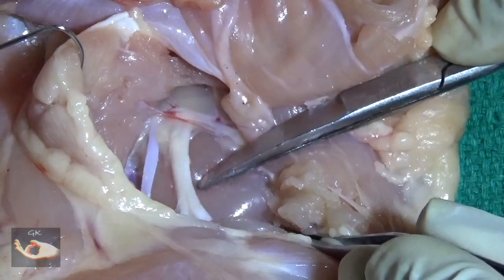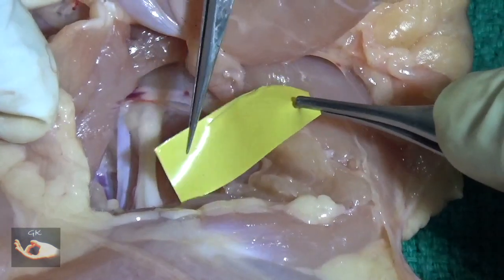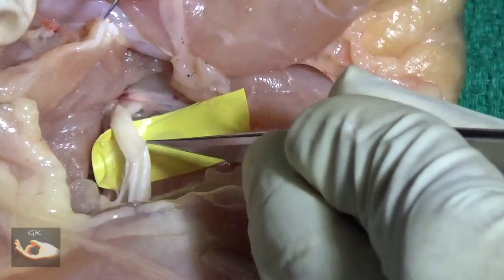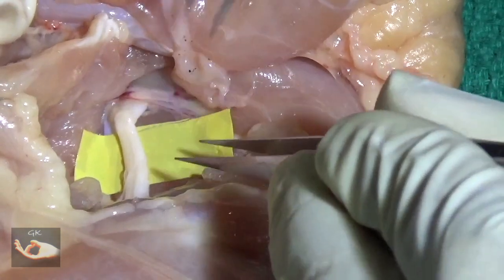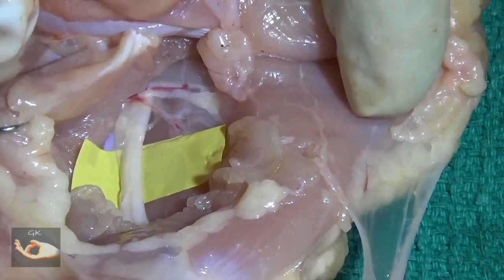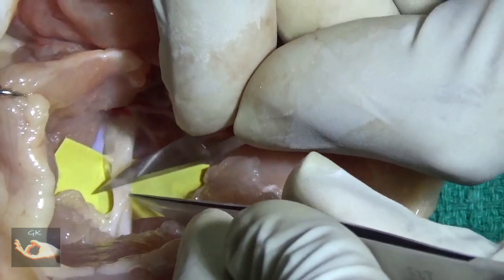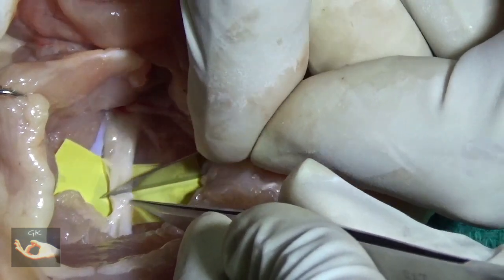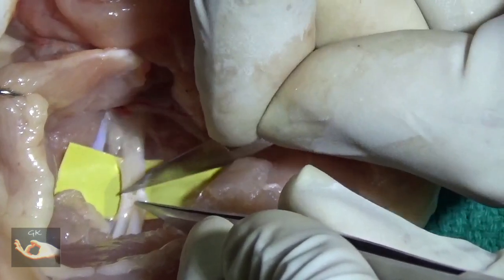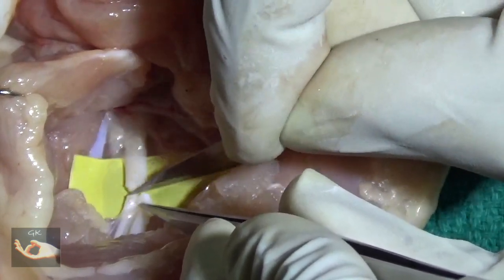This will be the site of the transection of the nerve for preparing for the microneural repair. First, apply the background material, cut quite narrow to avoid tenting of the nerve. Just before transecting the nerve, give a little traction on the nerve by extending the knee joint of the chicken leg. Using the number 11 blade, make a sharp cut in the nerve. As you make the cut, you will note that the ends of the cut nerve retract and the fascicles of the nerve pout out through the cut end.